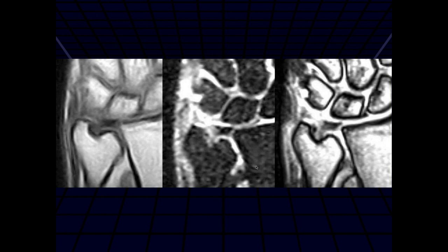So we have coronal images of the wrist. In the middle picture, there's some increased signal at the base of the styloid process. This is a T1, a STIR, and a T2 gradient echo. We can see the peripheral tear here.